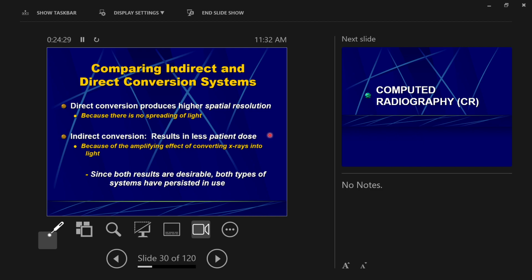So, if we can lower the amount of radiation being used on the medical side of things, then we can decrease the amount of overall radiation people are exposed to. Can't decrease your radiation exposure to your environment because you live in your environment, right? But you can decrease the amount of medical radiation used. So, assuming we have to take an X-ray on somebody, it's better to have something that gives the patient less of a dose.